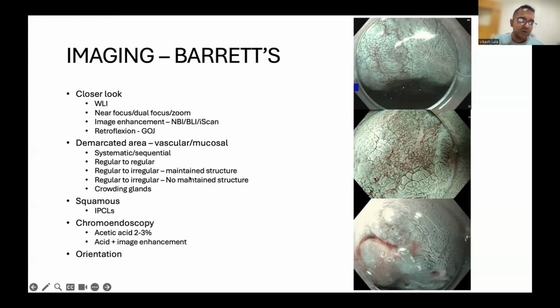And then the utility of chromoendoscopy, and I'm going to try and show you how that helps. So remember, when we're talking about Barrett's, you want to use acetic acid, and you want to use about 1.5 or 2% to 3%. There have been reports of acetic acid-induced colitis. So you ideally don't want to use 5% and 10%. I know a lot of centers do use vinegar, but the problem with vinegar is sometimes when you buy vinegar from the supermarket, it will just tell you on the bottle more than 5%. Is more than 5% 50%, or is more than 5% 5.1%? That's the big issue with it. So you can dilute down the vinegar, but ideally you want acetic acid 2 to 3%.